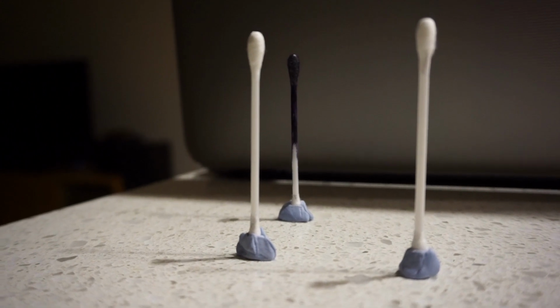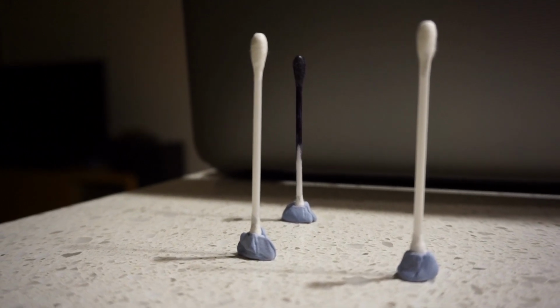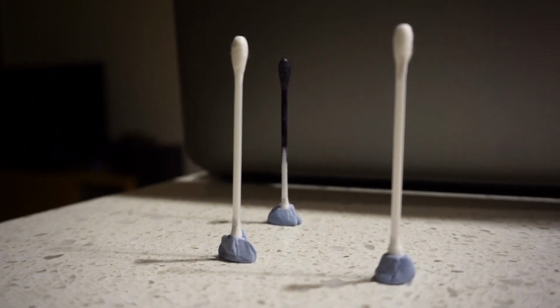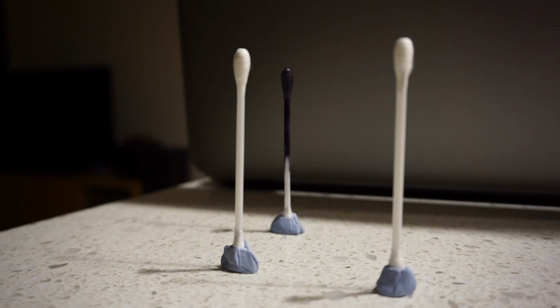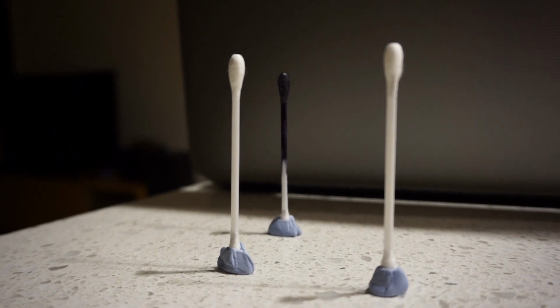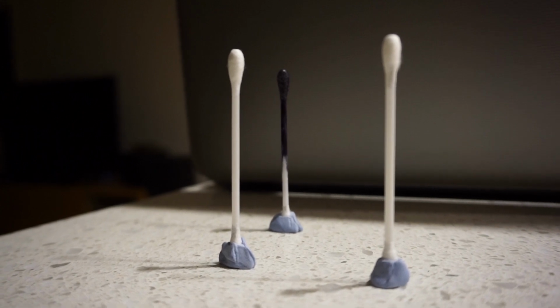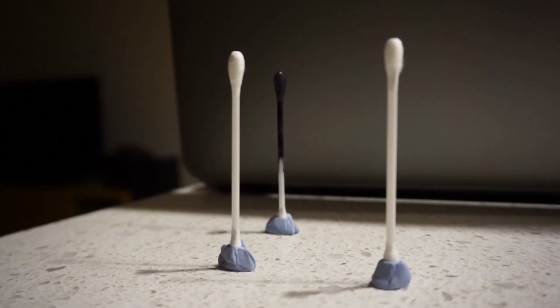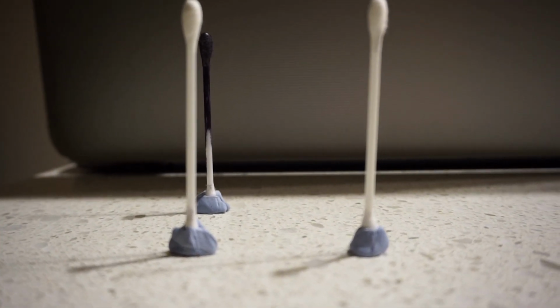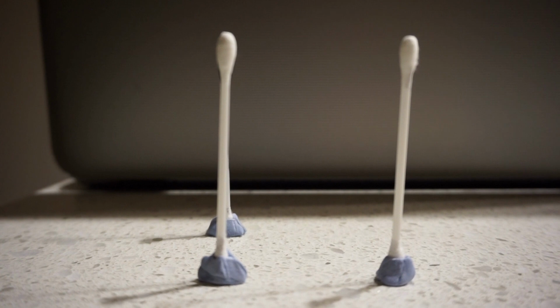Now, using the SLOB rule, same lingual, opposite buccal, the palatal root will go in the same direction as the collimator or the camera. So the black cotton bud is the palatal root or mesiopalatal root. The white cotton bud next to it is the mesiobuccal root, and the white cotton bud on the far right is the distal buccal root. As we come back around towards our right angle view of the upper fourth premolar, you can see that the mesiopalatal root now disappears behind the mesiobuccal root.